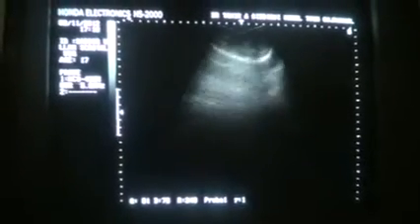And here we are again with the pathology.